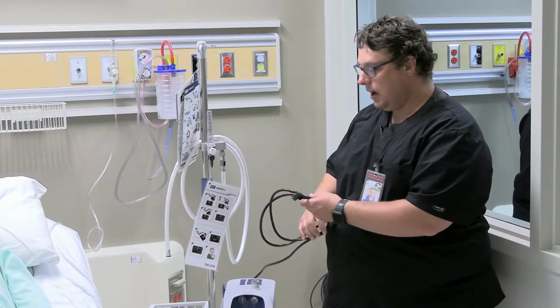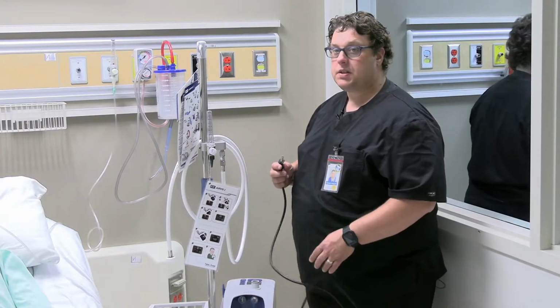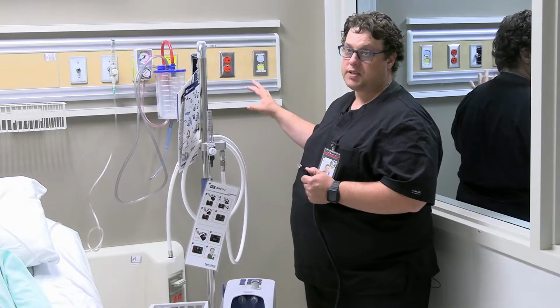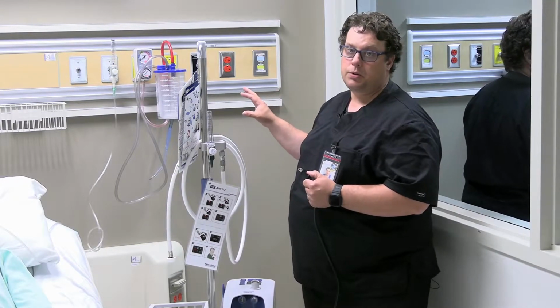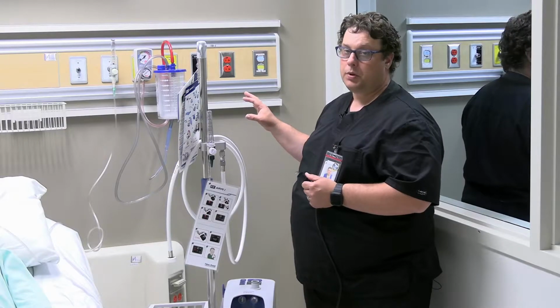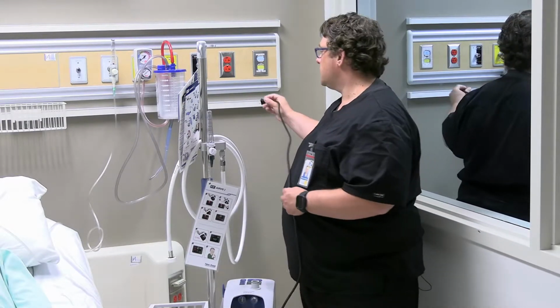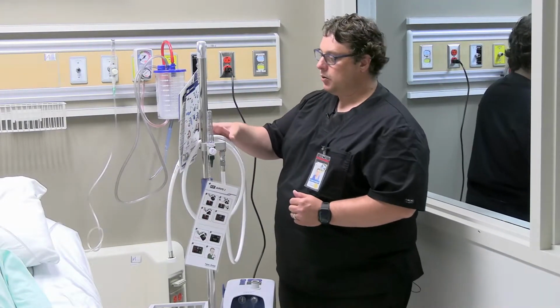So obviously we have our power connection. Now, based on your hospital policy, you will want to plug it into the appropriate power receptacle. In our cases here, everything should be plugged into the uninterrupted power supply at our organization. But again, you will follow your hospital policy when it comes to that. Okay, so we've plugged that into the power receptacle.